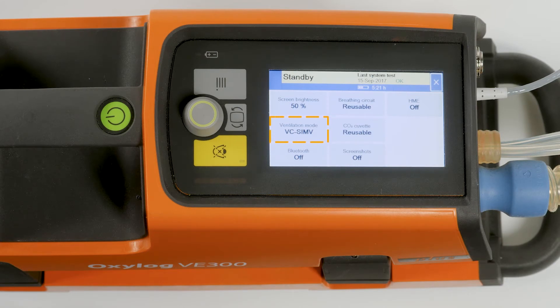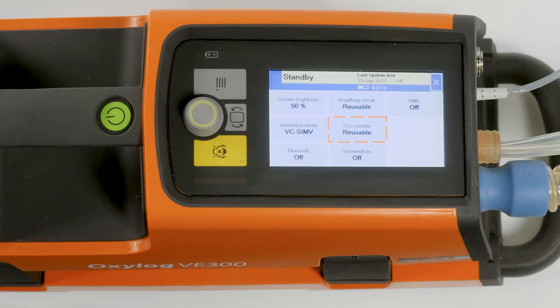The device can be set for the use of disposable or reusable CO2 cuvettes. The device can also be connected with another suitable receiver via Bluetooth.